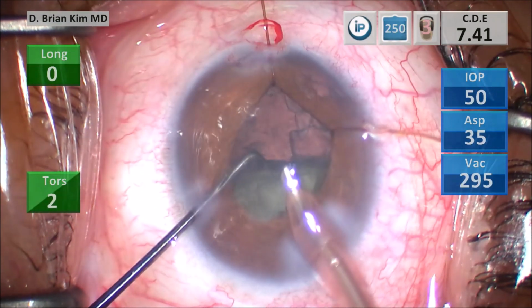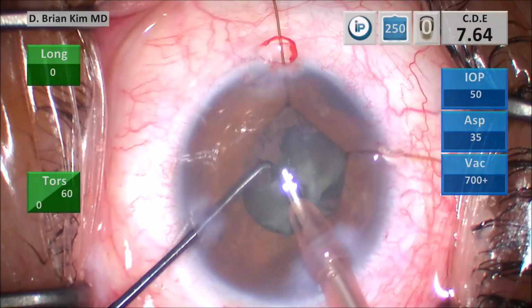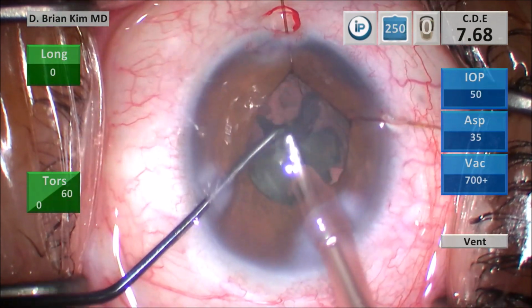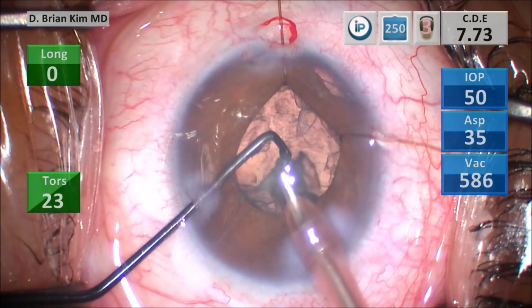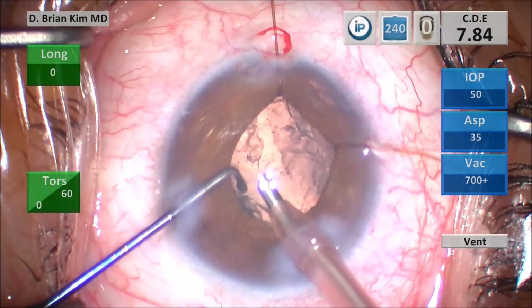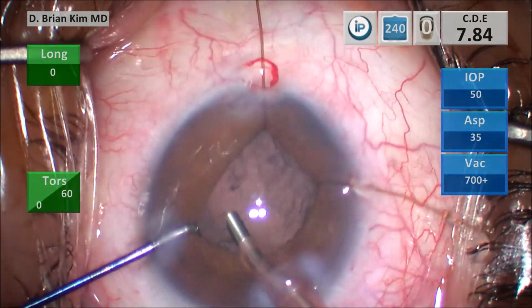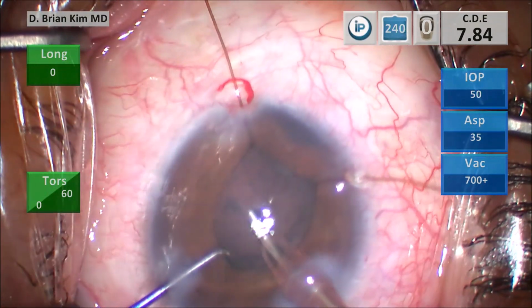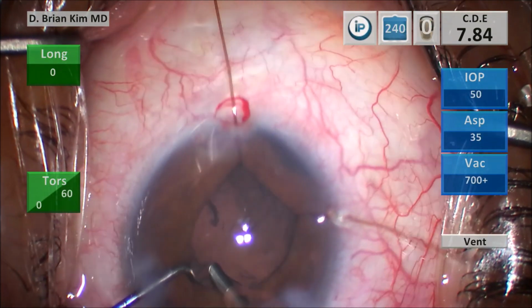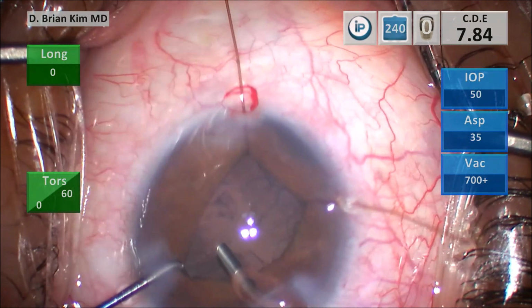So the lens piece is kind of turning around here. Go ahead and grab and get the chopper around the lens and emulsify it. I feel like one lens piece slipped down into the left from me. And I'm pretty sure there's a big chunk that fell back there, but I don't see it anymore. So I'm trying to retract the pupil with the chopper, looking around, and I don't really see it.